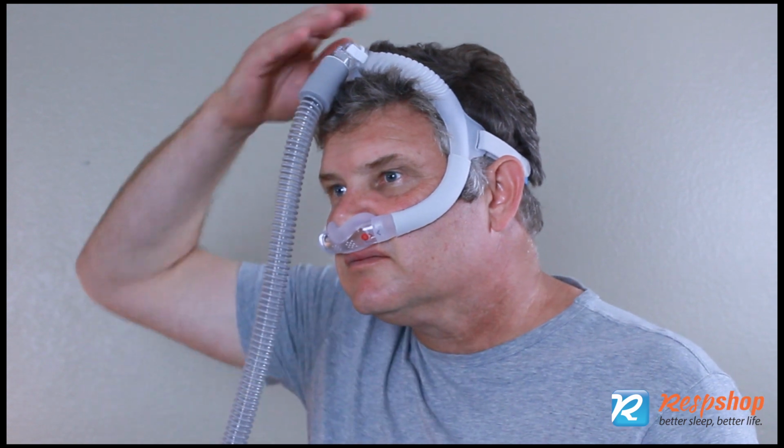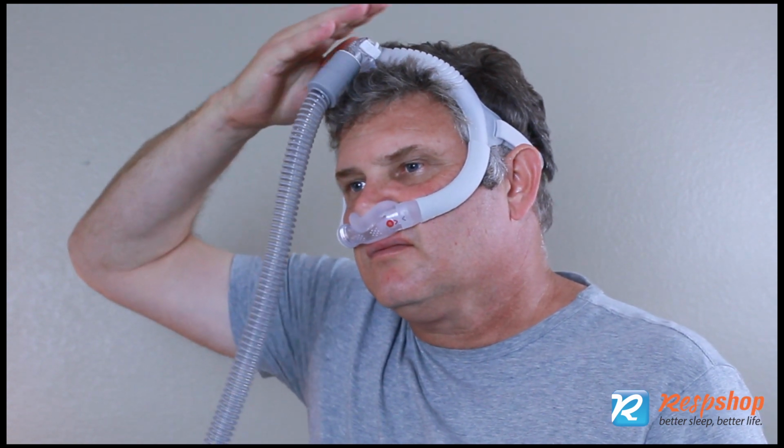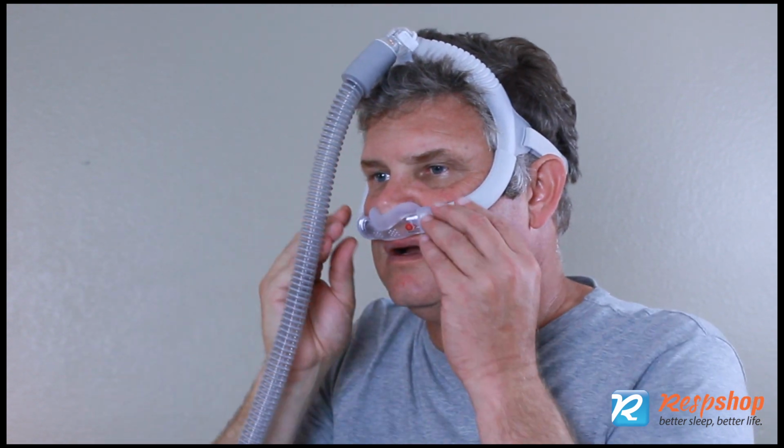Also, don't confuse a leak with exhaled airflow. Every mask has ports where exhaled air comes out. You should always feel the air escaping through those ports. The port may be on the circuit itself in addition to the mask.